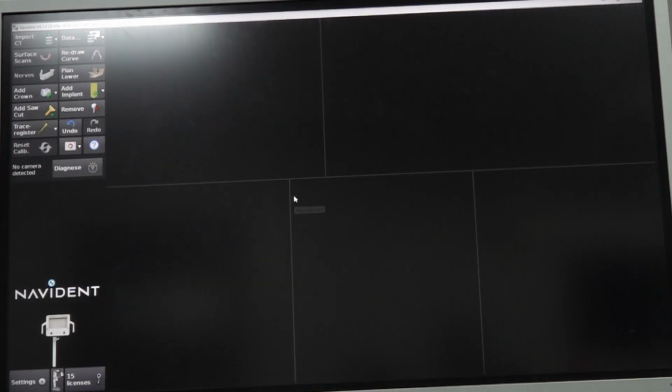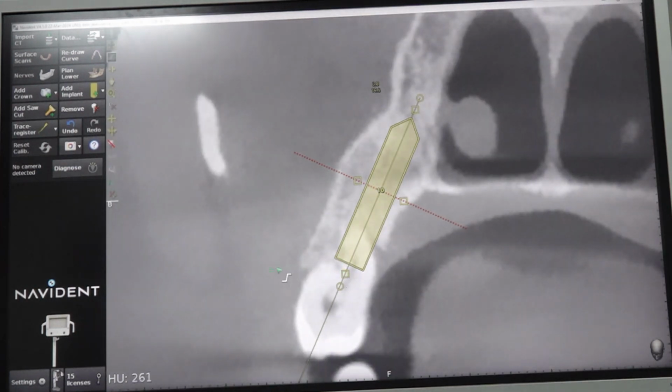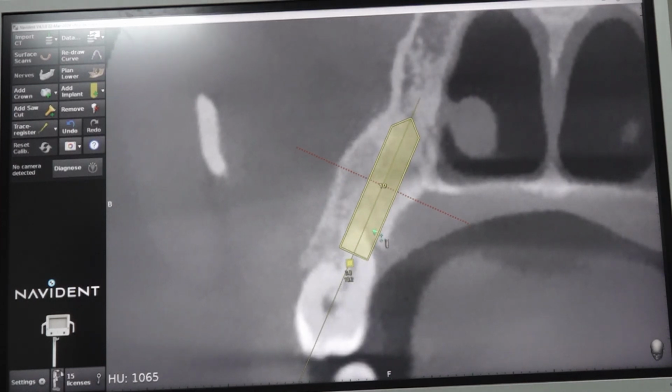What is the reason? Because here the teeth are present. If some resorption has happened, this entire crest will move upward. So you don't have to tilt very much palatally. Right? This is enough. Okay.